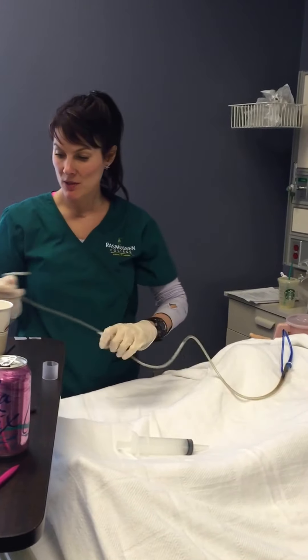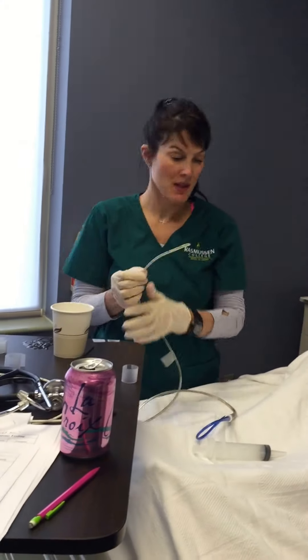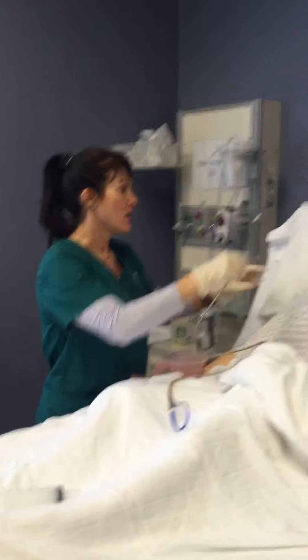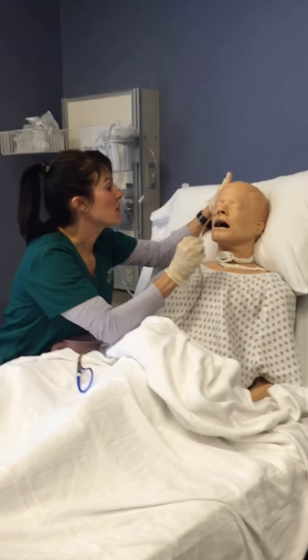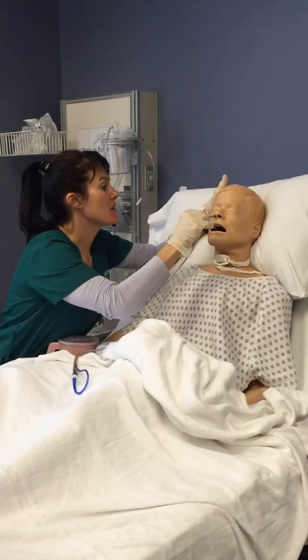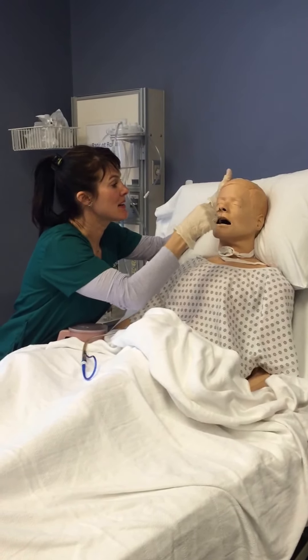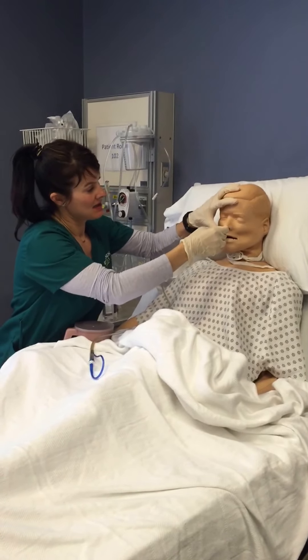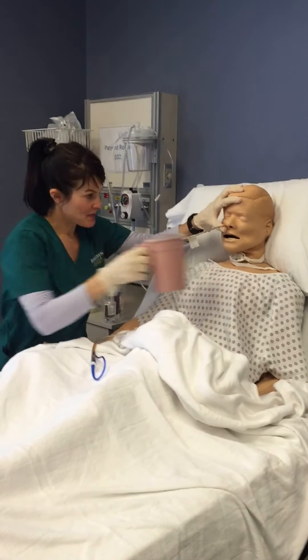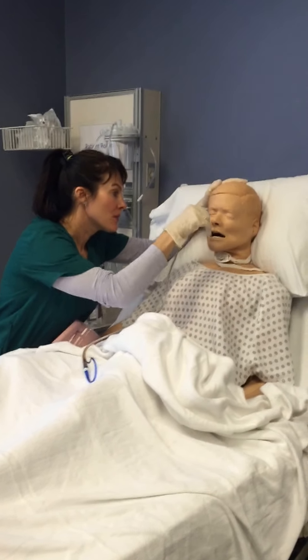I'm going to lubricate the end of my nasal gastric tube. I'm going to have you hyper-extend your neck. On three — one, two, three. As it's going down, it's going to feel like gagging. Once you feel the gagging and you're coughing, I'm going to have you put your head forward. Then I'm going to have you sip on your water as I continue to advance through placement.